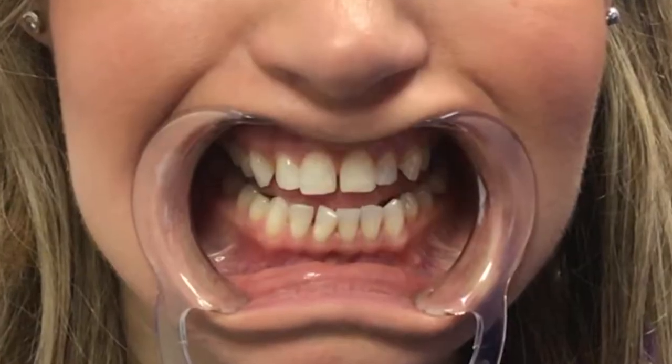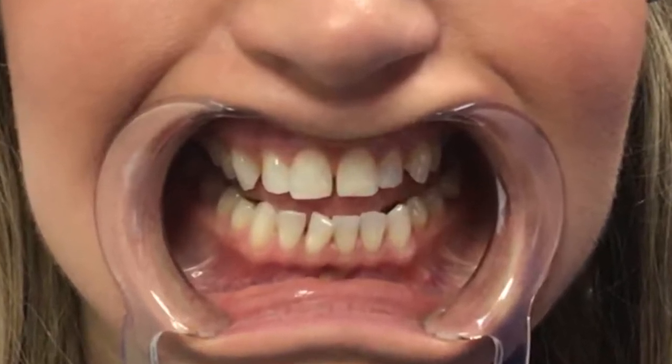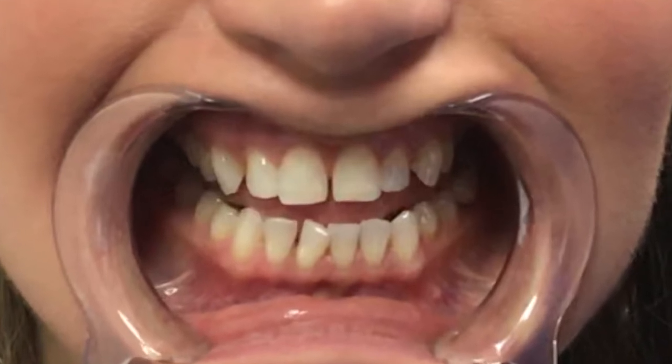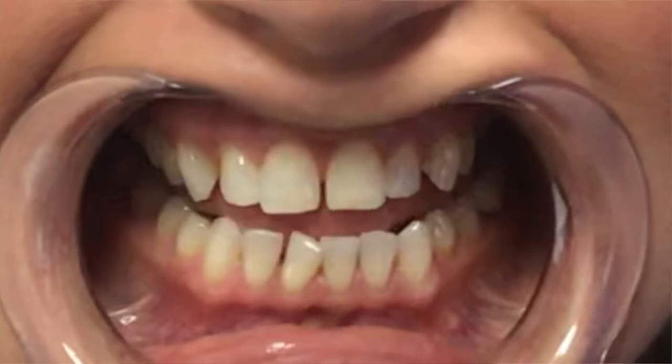So to see what my teeth looked like before — prepare to see the scariest smile ever. This is me when I first went into the shop for that scan, and I'm wearing what they call a smile extender so you can see right to the back of my mouth. From that original scan you'll see that I had quite a significant gap between my front two teeth, gaps to the side as well, and then a really crooked bottom middle tooth that was crossing quite far over onto the other one.